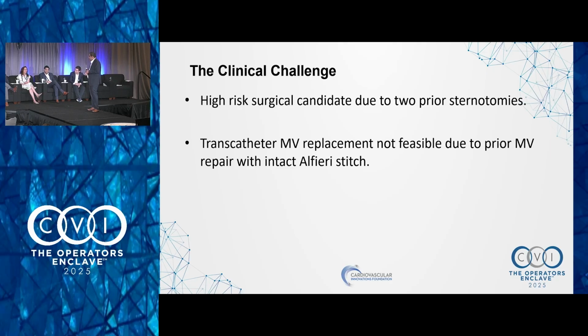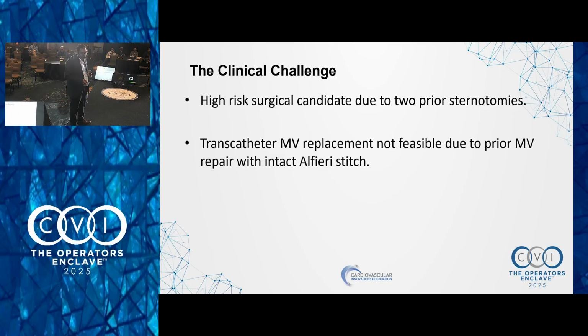And the issue is going to be in the commissures. Well, I'll let others speak. My experience of plugs near clips in the commissures has not always been great because the corners of the valve annulus can be a little bit difficult to judge in terms of the sealing. So I don't know. Others?